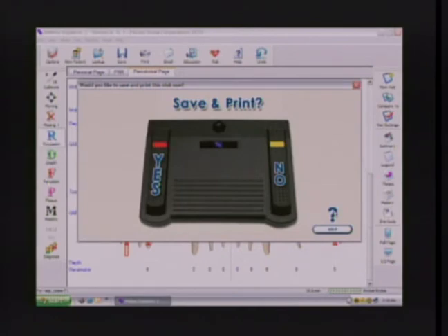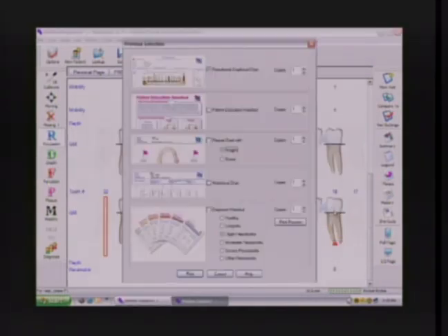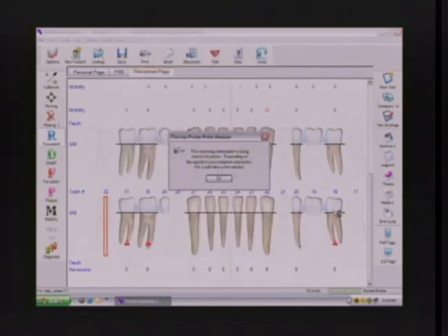Yes. So we can say yes. Okay. It's now saved to the database, took us to our print options. We select what and how many we want to print, defaulted to what we did last time, and we can send it to the printer with the foot pedal, just stepping on the center pedal. And it's gone.